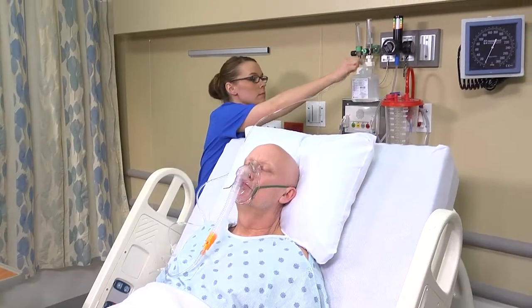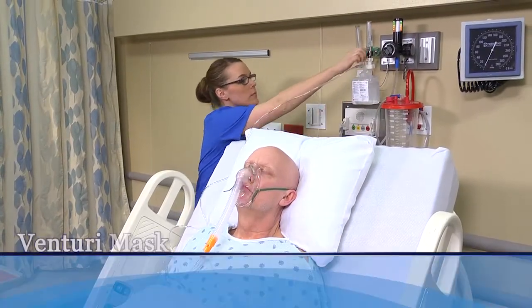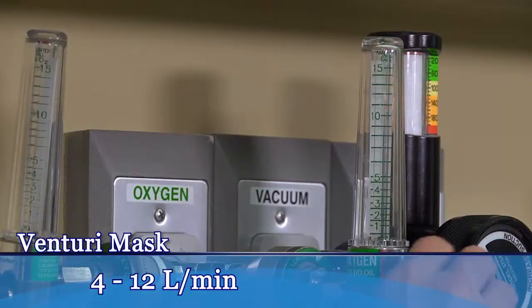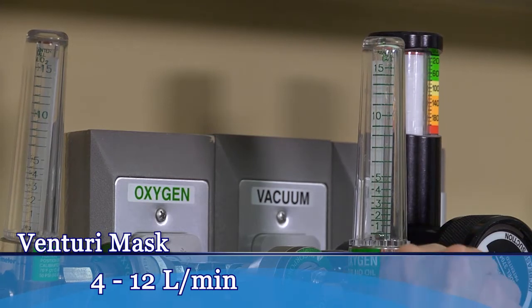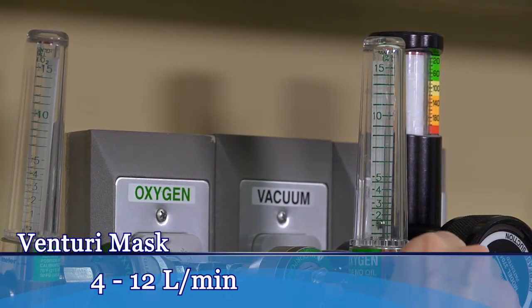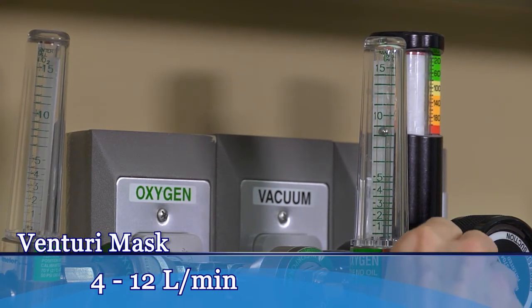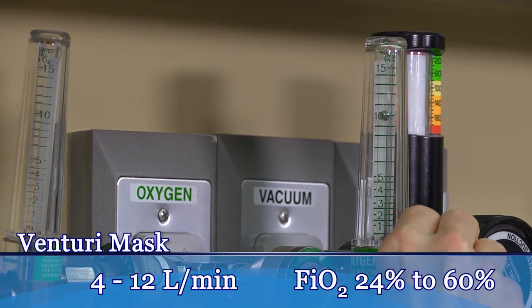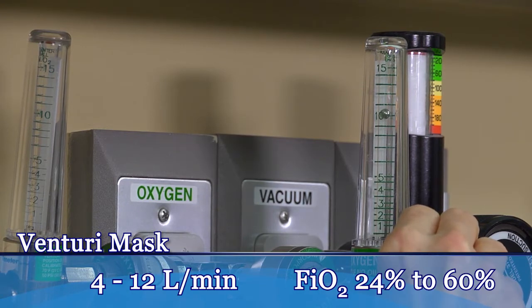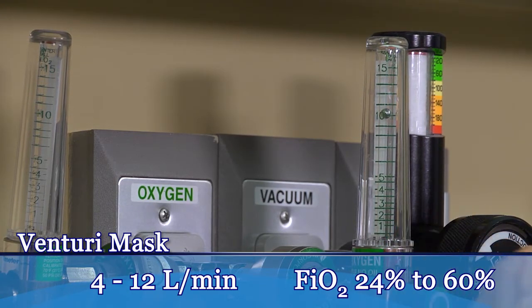For a Venturi mask, plan to set the ordered flow rate between 4 and 12 liters per minute. To deliver a preset FiO2 of 24 to 60 percent, either use the correct adapter or turn the barrel on the mask.